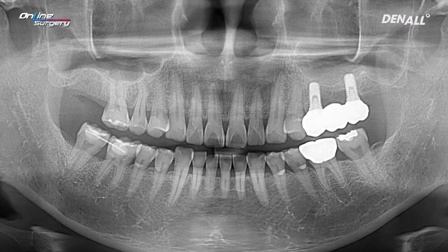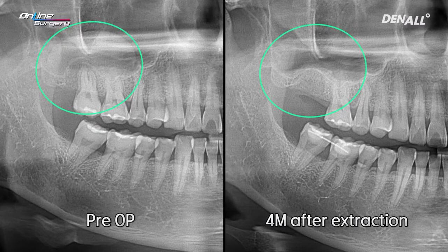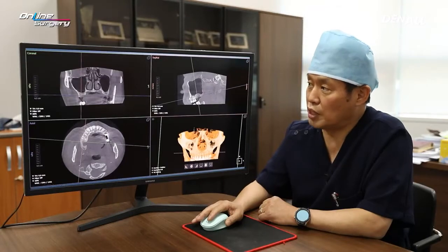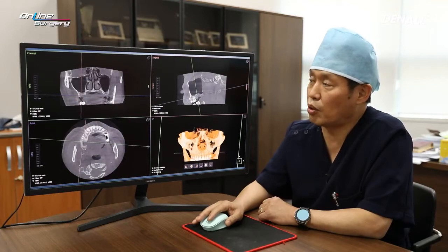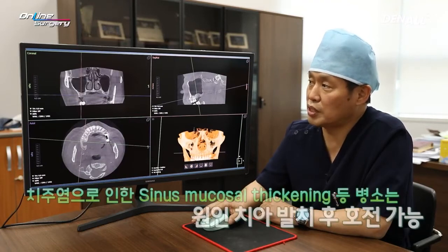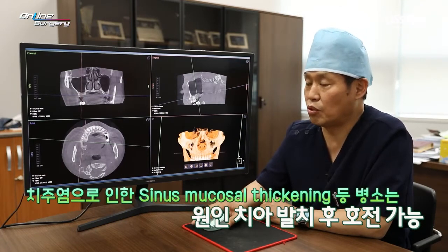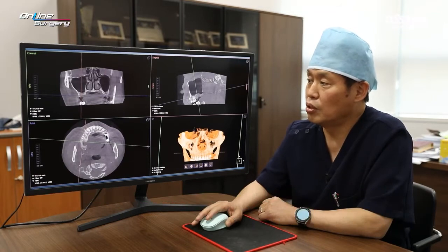At initial visit, there was a dome-shaped lesion within the sinus cavity. However, now it is gone. On CT, the lesion was completely gone. Very frequently, when a problematic tooth is extracted, the mucus retention cyst or mucosal thickening within the sinus also disappears. Even if mucosal thickening is severe, in most cases it is restored to the original state. In this case, the lesion is completely gone within the sinus.